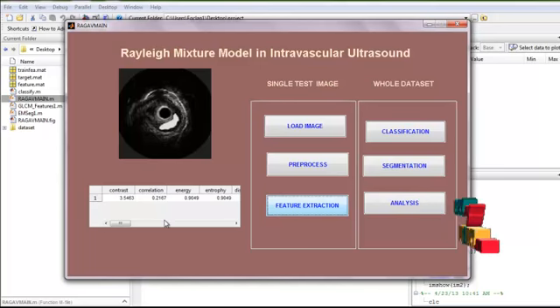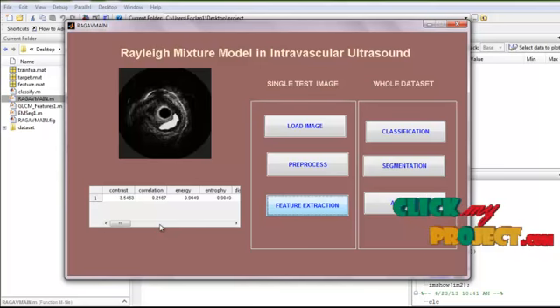These statistics provide information about the texture of an image, such as angular second moment, entropy, contrast, inverse difference moment, correlation, sum of squares, sum average, and variance. Entropy will be calculated for the texture image.